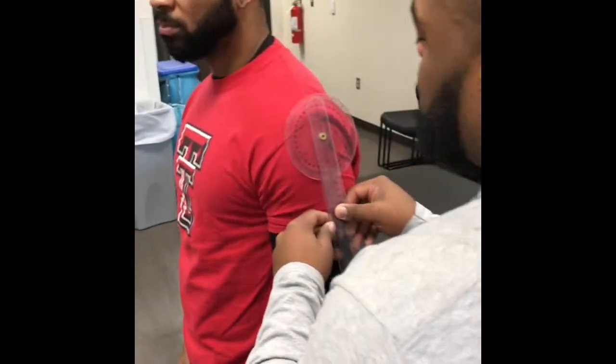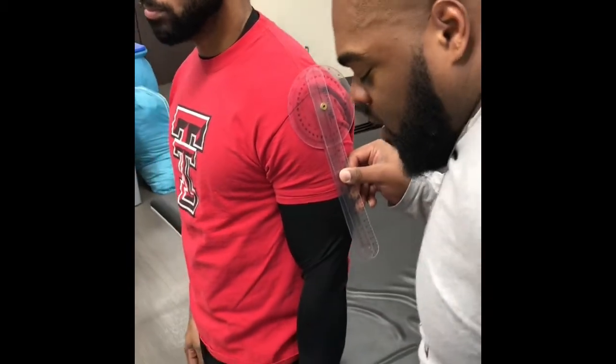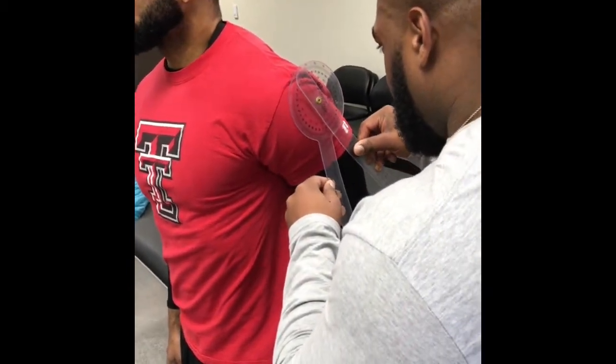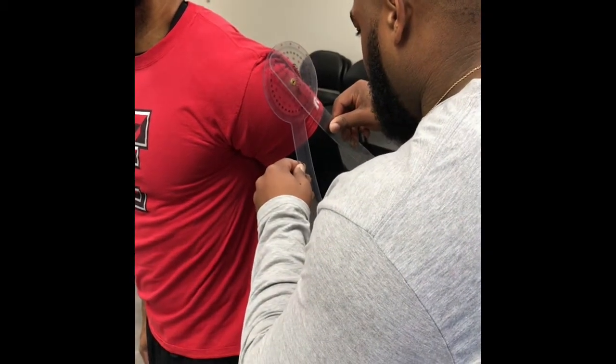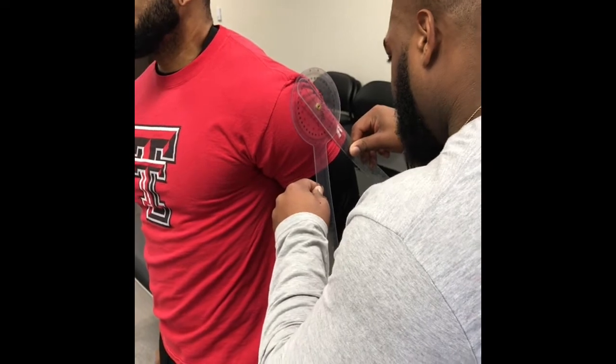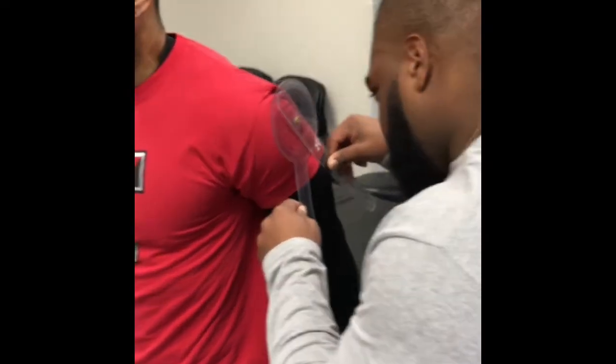Right now we're about to do some shoulder extension, so if you would please bring your arm back like that, as far as you can. And the normal range is 0 to 60, and he is at 47.